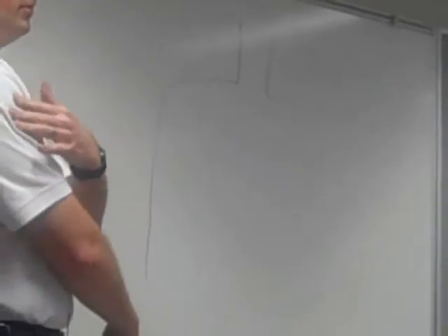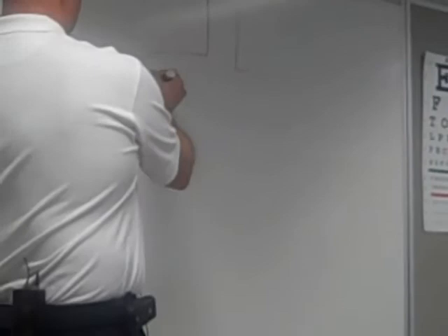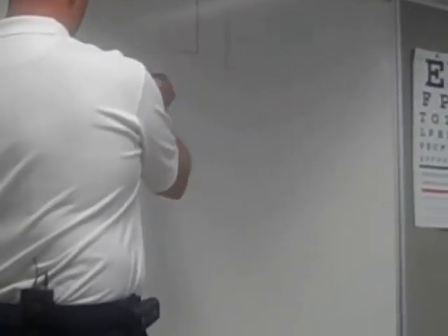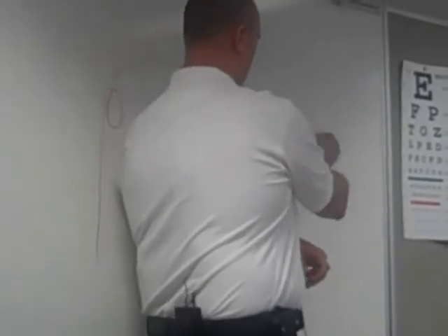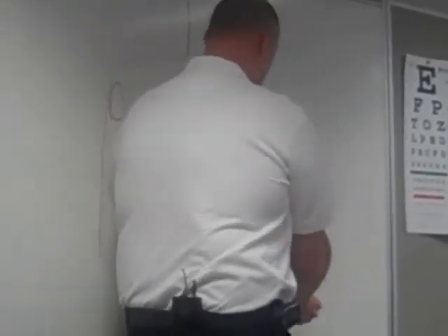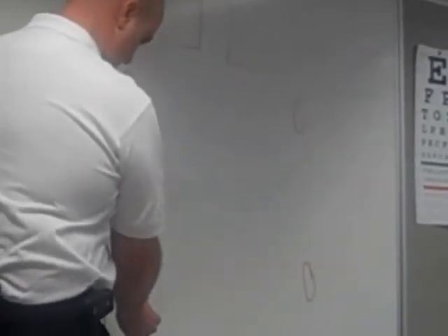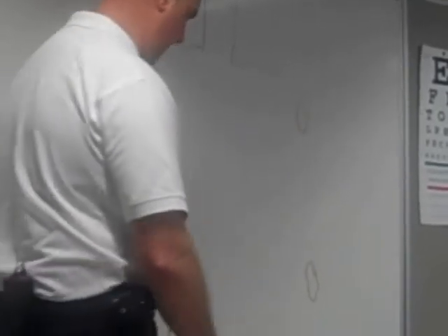You want it on your muscle. So the same as what we did earlier, your white wire would be right here, black one, red one, and then your green one. And again, these are down on your legs, limb leads.